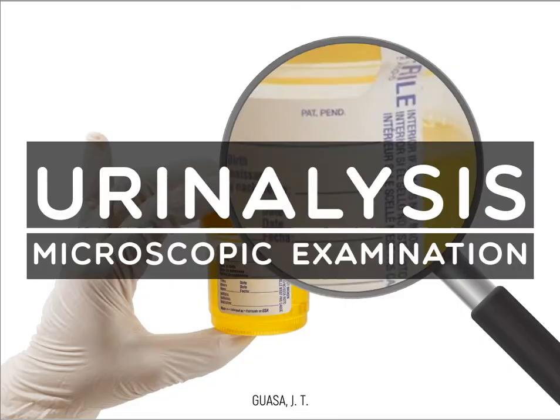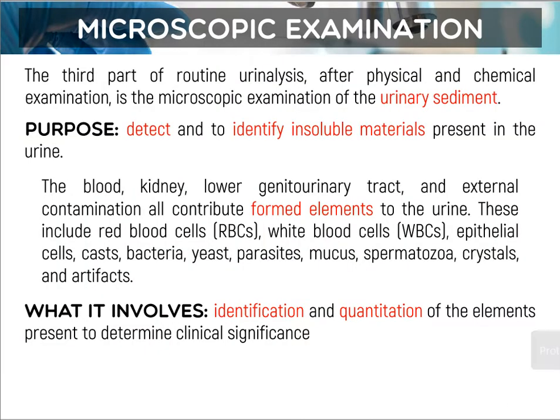Alright? So, microscopic examination, as what I've said, is the third part of routine urinalysis after physical and chemical. It is the microscopic examination of the urinary sediment. Its purpose is to detect and identify insoluble materials present in the urine.